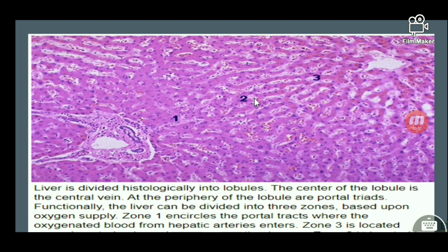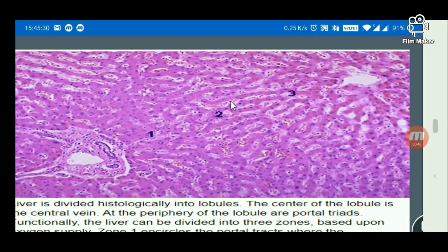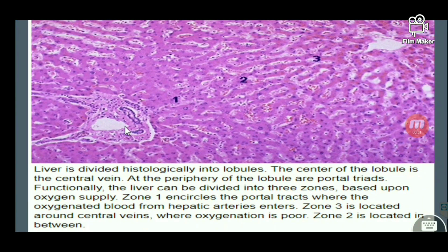Before we move on to cirrhosis, we should know how the normal histology of the liver looks. The liver is divided histologically into lobules. Each lobule has a central vein at the center, and around it is a hexagon. At the edges of the hexagon are the portal triads, each showing three structures: the hepatic artery, portal vein, and bile duct.